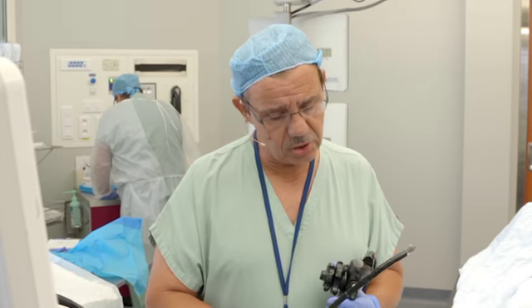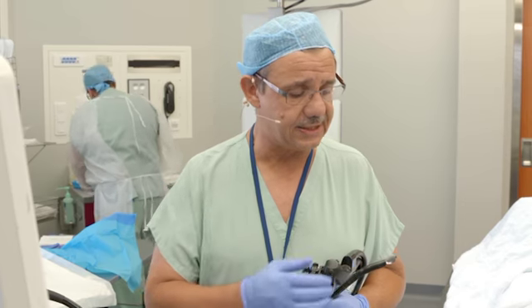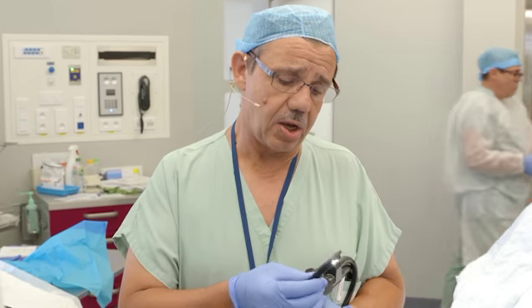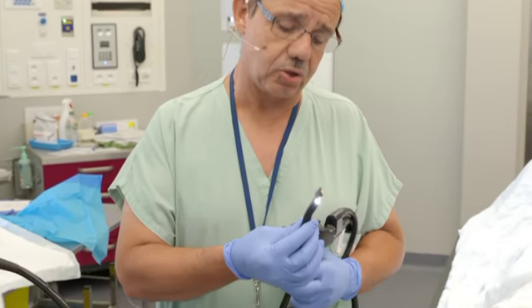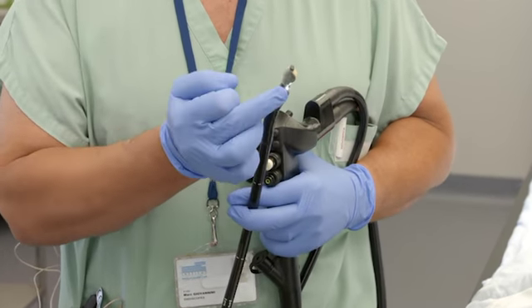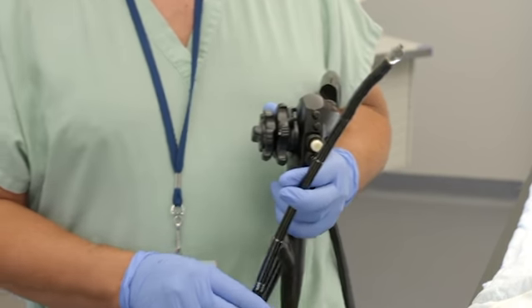I use the other scope from Pentax. This is the slim EUS scope, the EG32 UT, which is a small EUS scope of 11 millimeter of diameter, with a very small EUS probe. It's always connected to the previous machine. The advantage of this scope is that we can pass easily the stenosis, and also we have quite a nice endoscopic image.